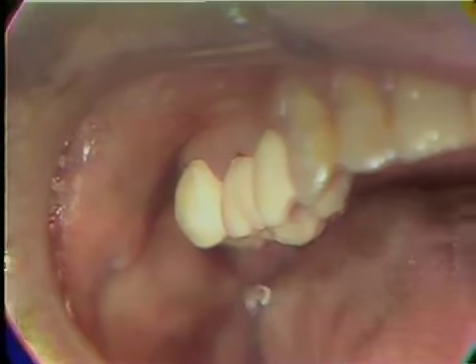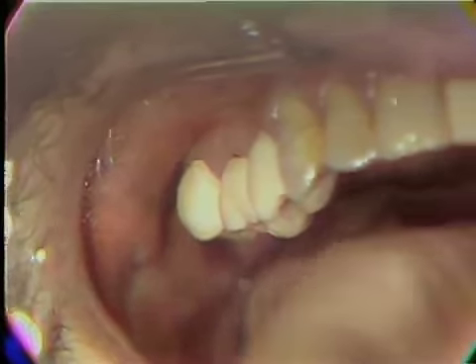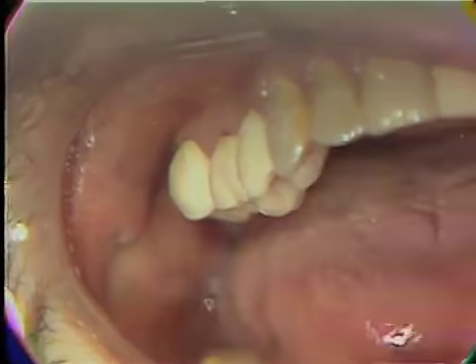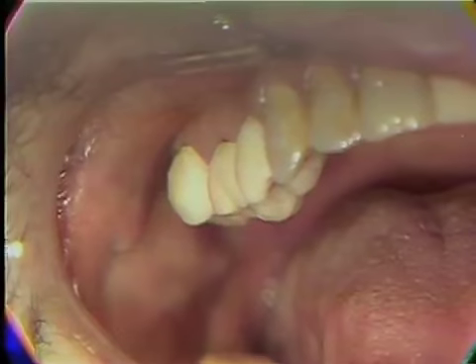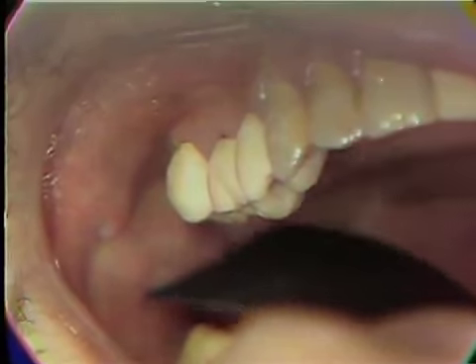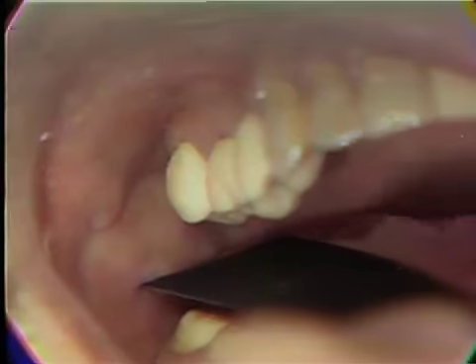Occlusion is an important aspect. If you've got faulty occlusion, this can cause traumatic problems on the teeth and also cause the teeth to move orthodontically. So it's important to make sure the occlusion is as good as you can get it.